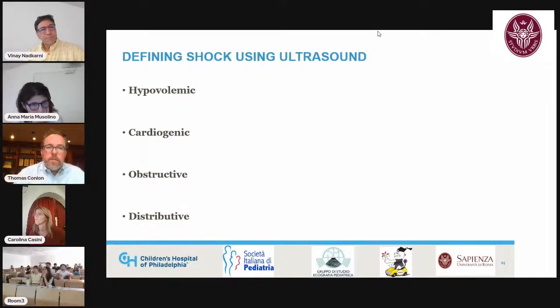So how do we define shock using ultrasound? And I want to use similar terminology to what we're used to in bedside assessment: hypovolemic shock, cardiogenic shock, obstructive shock, and distributive shock.